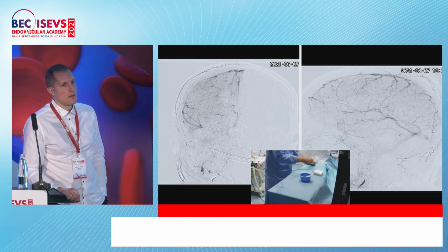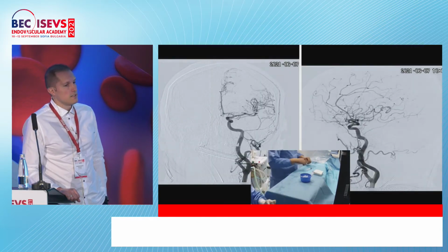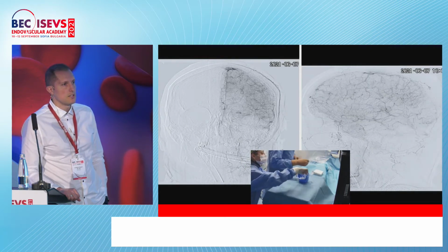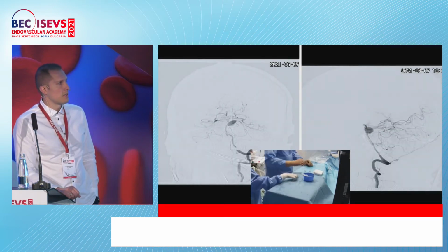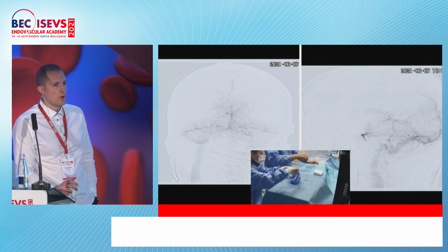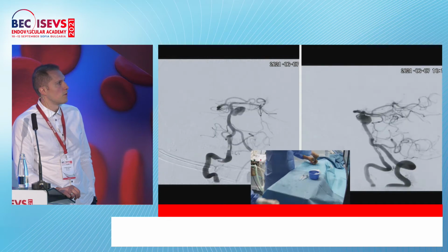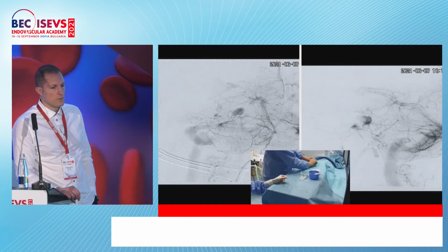It's a ruptured mid-basilar aneurysm, a very hairy condition. You see it's like a dissecting aneurysm, which we decided to treat in the acute phase with this new P48 stent with coating. It's called HPC, hydrophilic coating, which allowed us to put the patient under only mono antiplatelet therapy. So these are the images from the procedure.